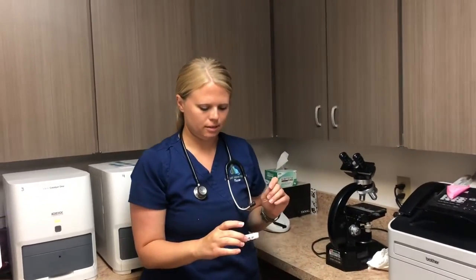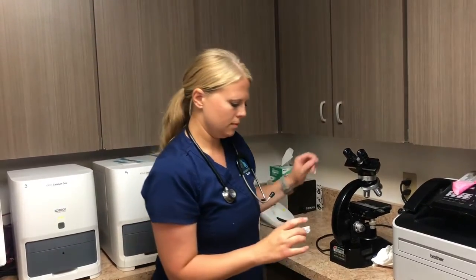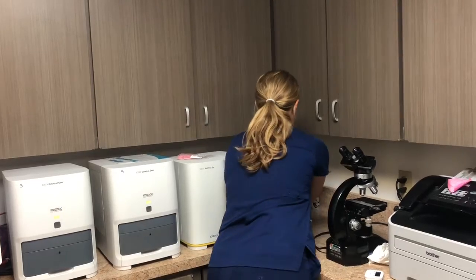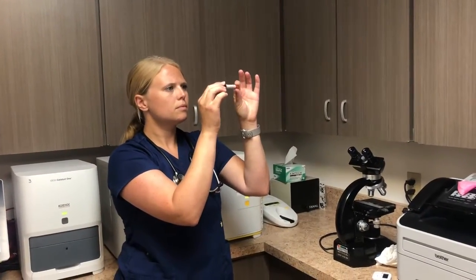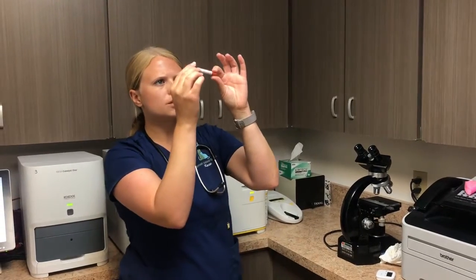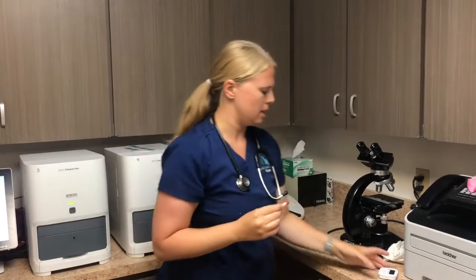Wait another 5 seconds. Perfect. And then this one's starting to form a clot here. So his activated clotting time is about a minute and 20 seconds.